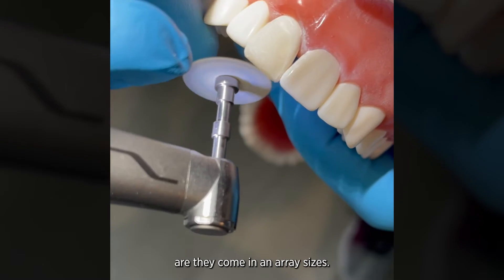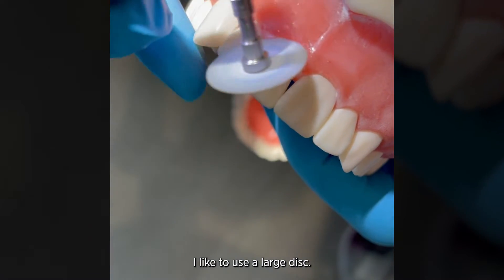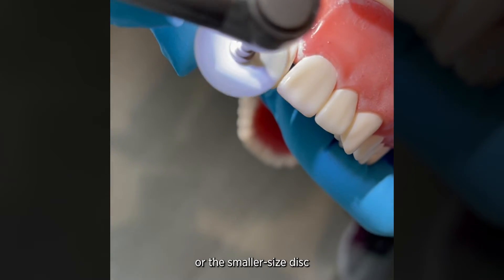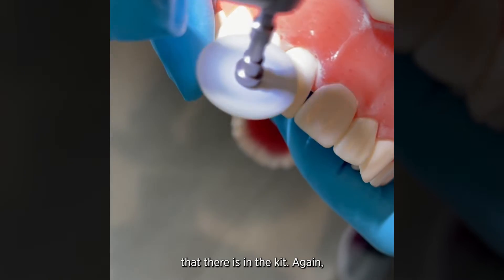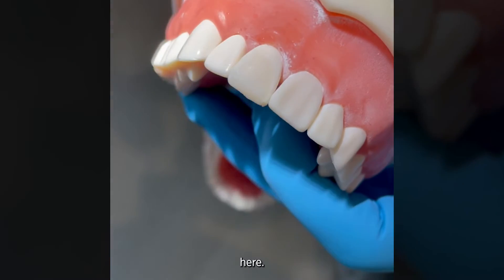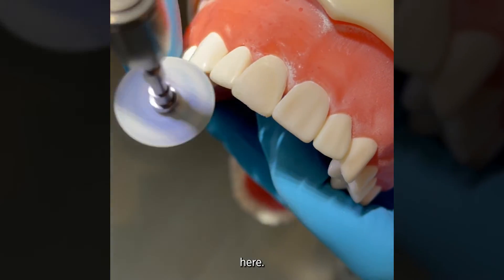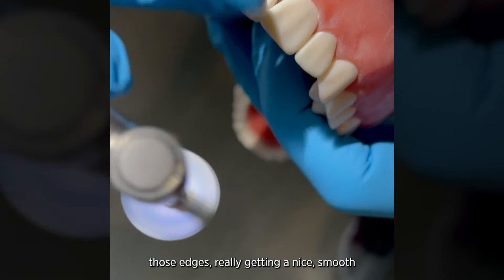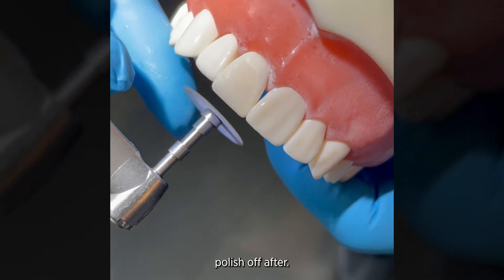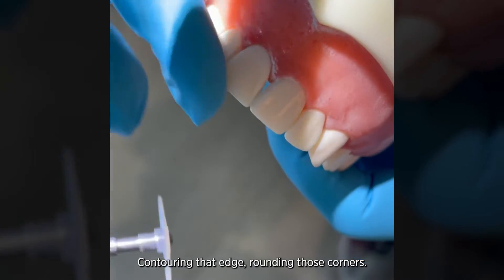The nice thing about these discs is they come in an array of sizes. For my central incisors, I like to use a large disc — it's more efficient for me — but if you are working on a smaller tooth, you can use the medium-sized disc or the smallest size disc in the kit. You can see I'm using really light pressure here, just buffing out those edges and getting a nice smooth base that I can polish off after. Contouring that edge, rounding those corners.